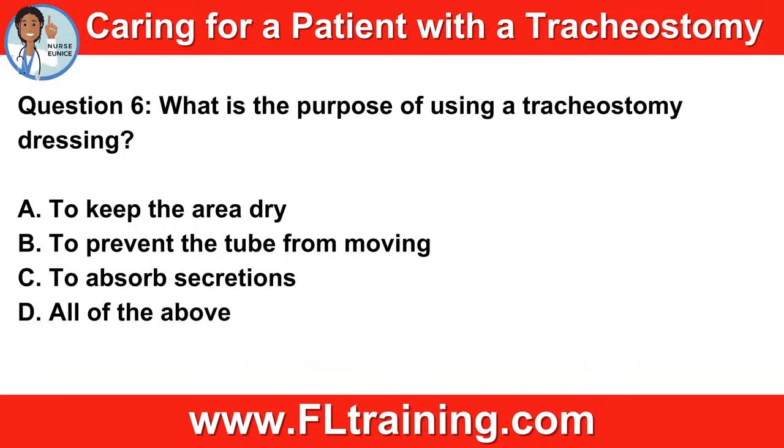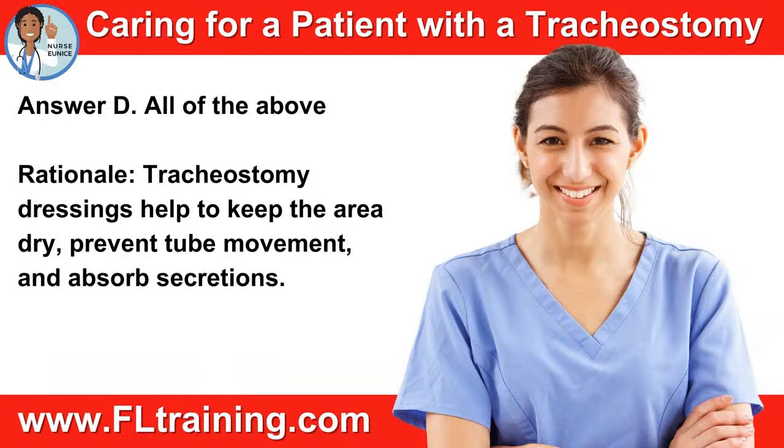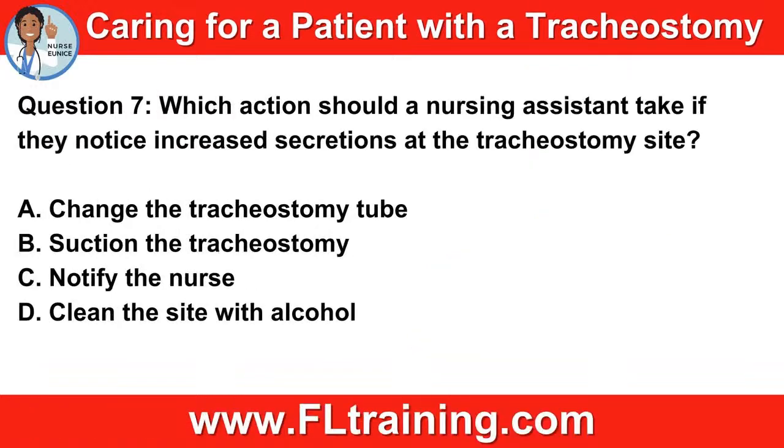but sterile saline is recommended for cleaning the tracheostomy site as it is gentle and effective without causing irritation. Question number 6, what is the purpose of using a tracheostomy dressing? Is it A, to keep the area dry, B, to prevent the tube from moving, C, to absorb secretions, or D, all of the above? And if you've not seen a tracheostomy dressing before, you'll see it on the next screen. Oh, you all are amazing caregivers because you all knew it was D, all of the above. So, tracheostomy dressings help to keep the area dry and to prevent tube movement and to absorb secretions. And I'll make sure I show you that dressing on one of the subsequent slides.